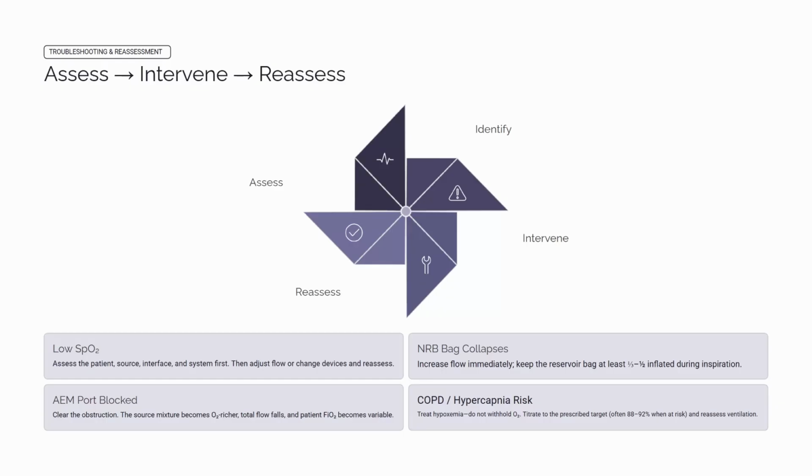On the patient side, look at the SpO2 trend. Is this a real, sustained drop or a brief dip that's already recovering? Check their respiratory rate and their work of breathing. Check mental status and skin color. Are they comfortable? How do they look overall beyond just the number on the monitor?